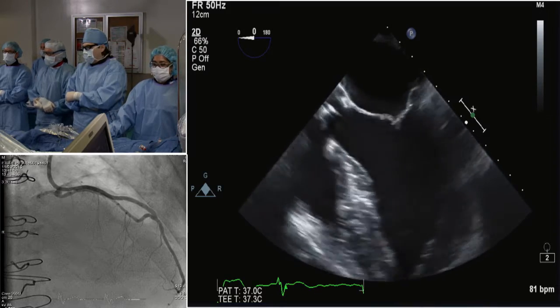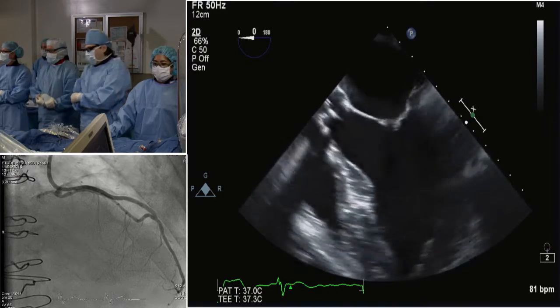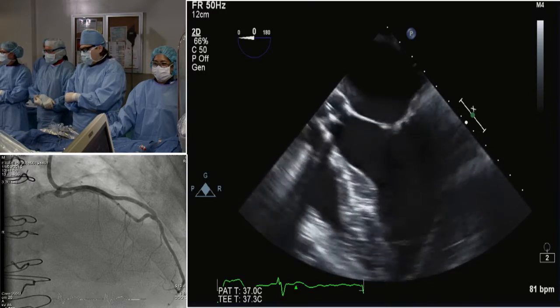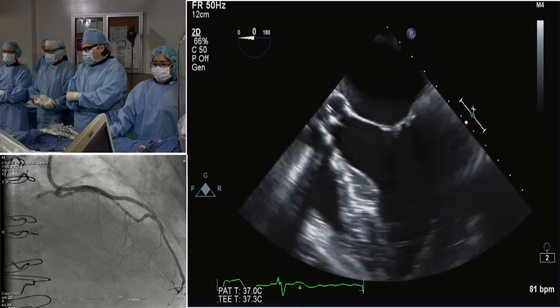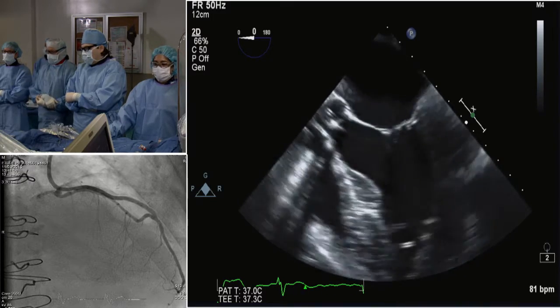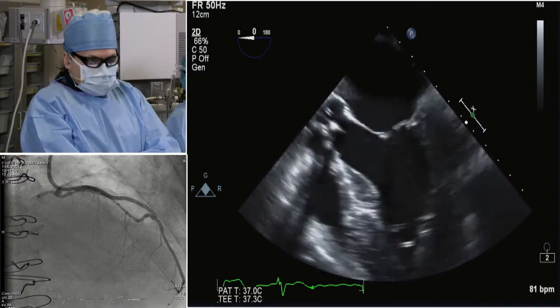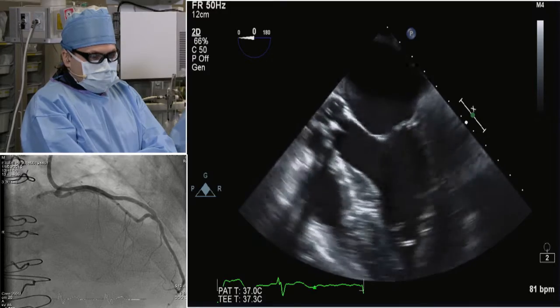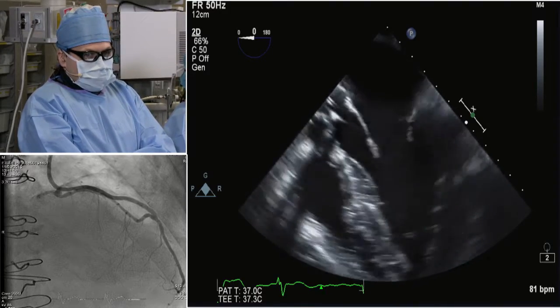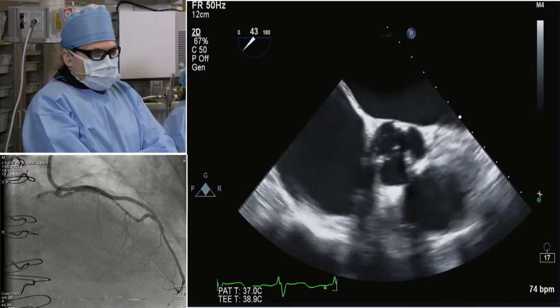If you look at some of the US CoreValve data that came out from the randomized trial, they found that the cutoff for significant paravalvular leak is about 1,100. So you guys are in the, I would say, severe range of calcification. From some experience in China, where the amount of calcification is about 2 to 4 times what we see here in the Western world, I think in this patient I would definitely pre-dilate, especially if we're using a self-expanding valve.